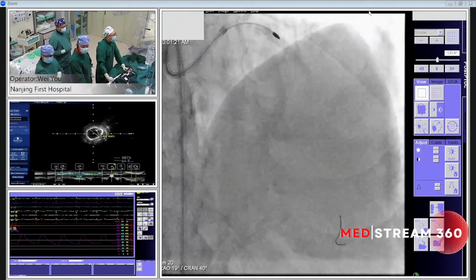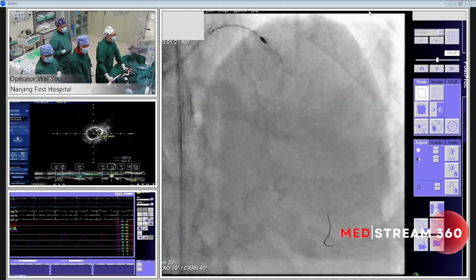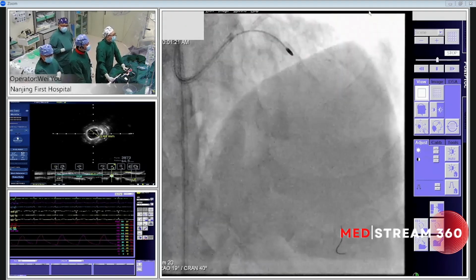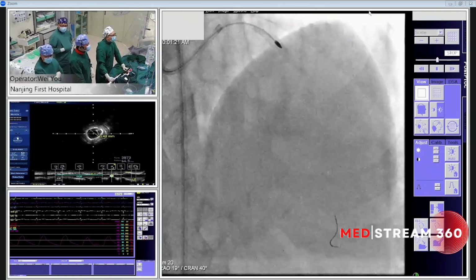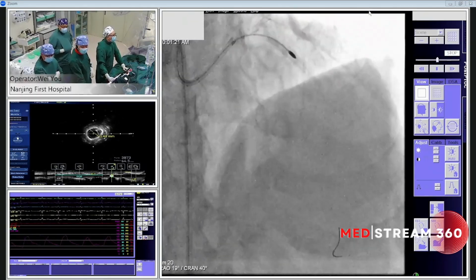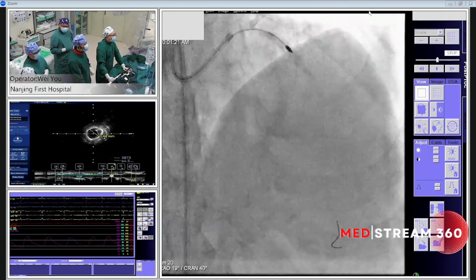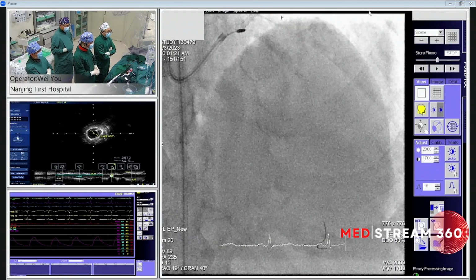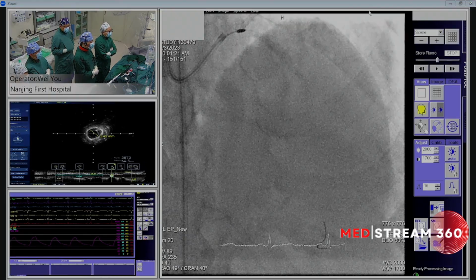160. Okay. We just gently touch the lesion. The speed is 10. 160,000 RPM. 15 seconds. Okay. The speed is maintained. The patient is stable and the hemodynamic is stable without any ECG change. Okay, second round.